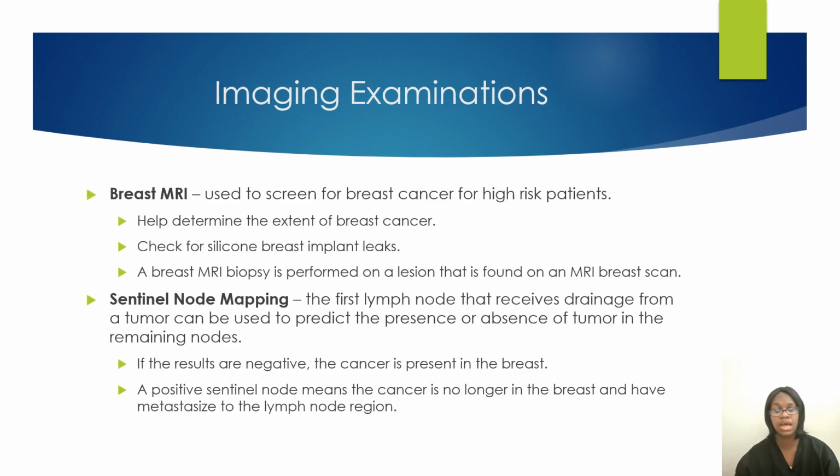For your breast MRI, I work as a breast MRI tech, or an MRI tech as well. Breast MRI is used to screen patients at high risk of breast cancer, for implant problems, if a patient was just diagnosed with breast cancer, for a patient with dense breast tissue, or someone at high risk for breast cancer, depending on their medical history or family history questions.